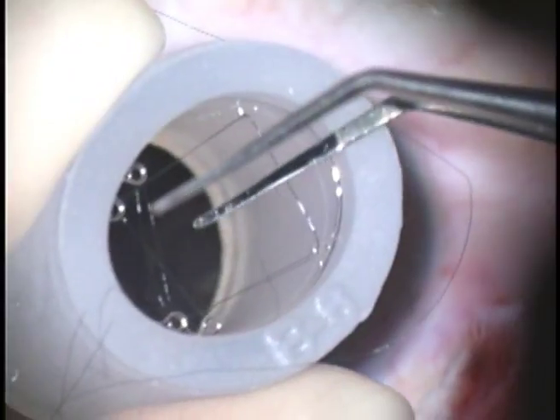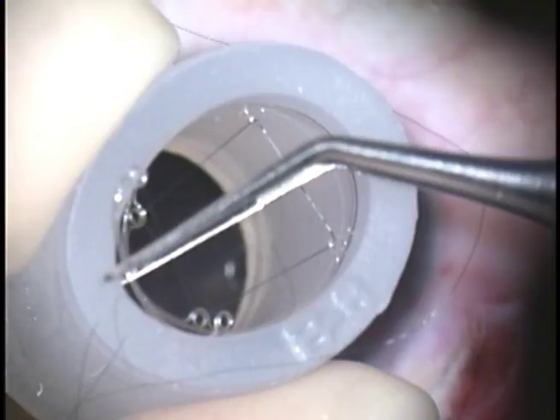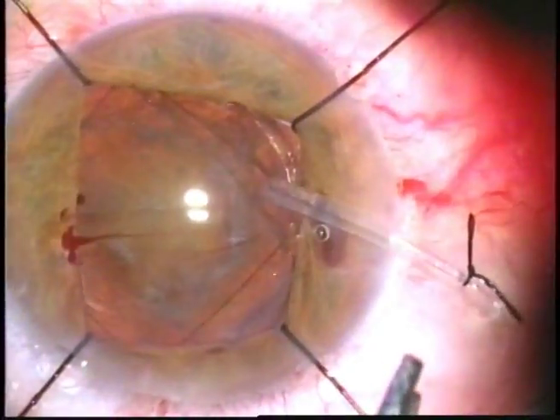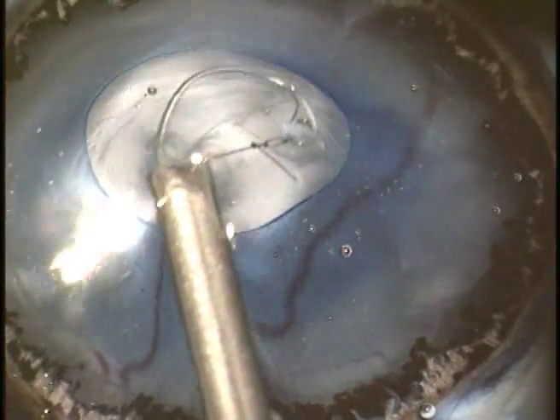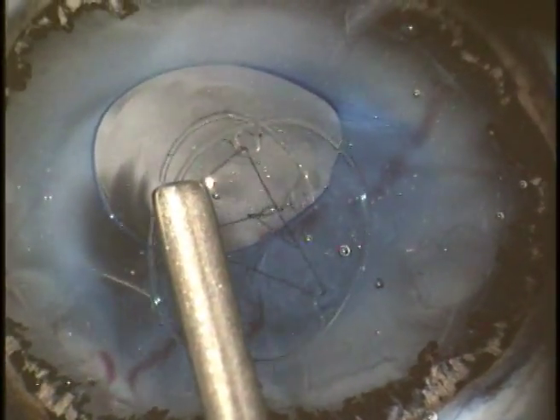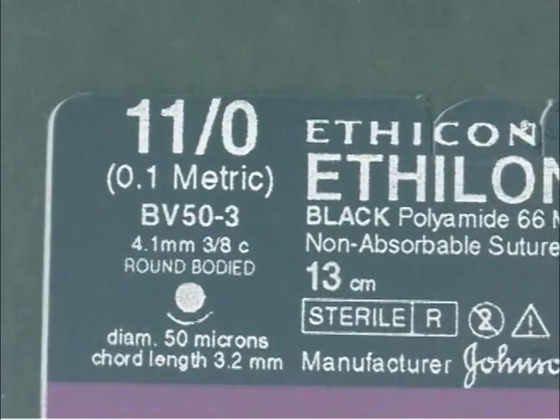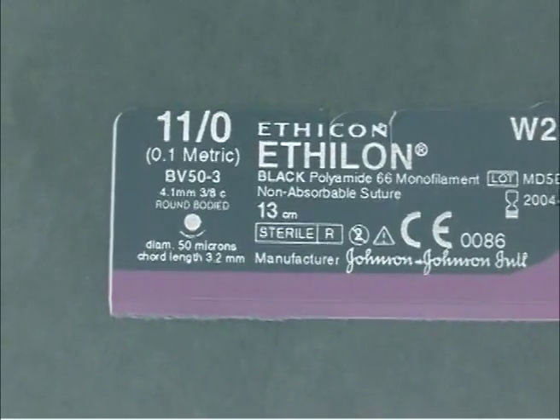Threading a cord through each eyelet during surgery is time consuming, so the pulling cord and the capsular tension ring should be provided pre-packaged together and ready for use. More research has still to be done to provide an easy-to-use cord locking and ring delivery system. The injector has still to be refined to deliver the ring in a calculated reduced diameter, aiding to release the cord and remove it in a simple and safe maneuver. The eyelets can be improved, and the cord material could be improved — for example, using a biocompatible or biodegradable material to avoid the need for removal entirely.